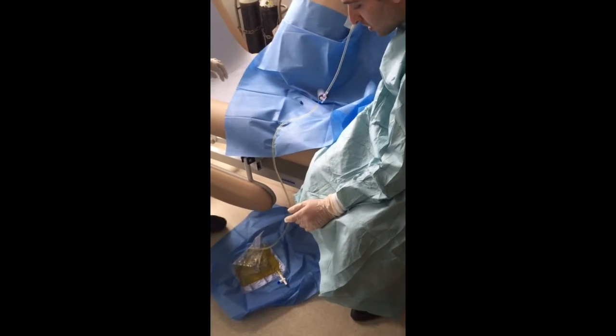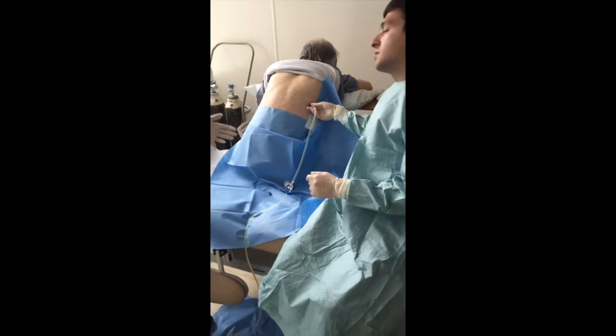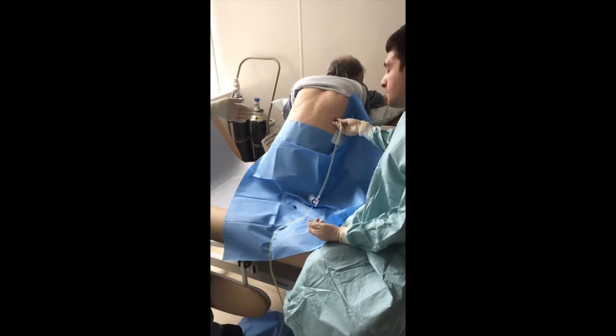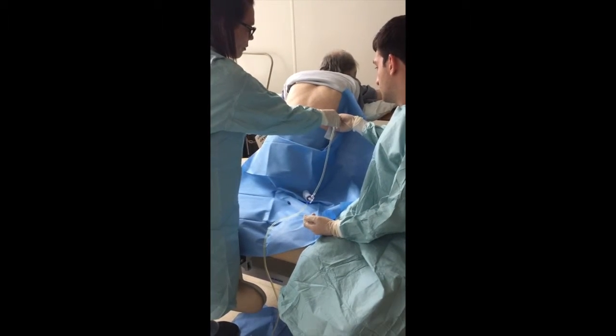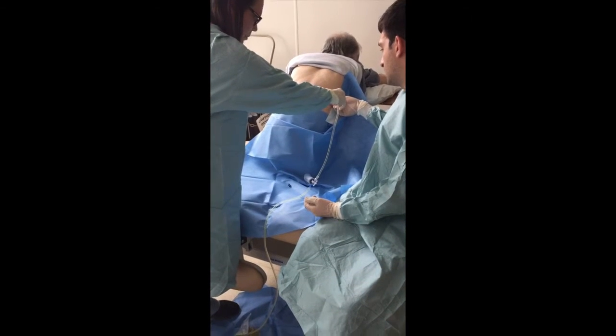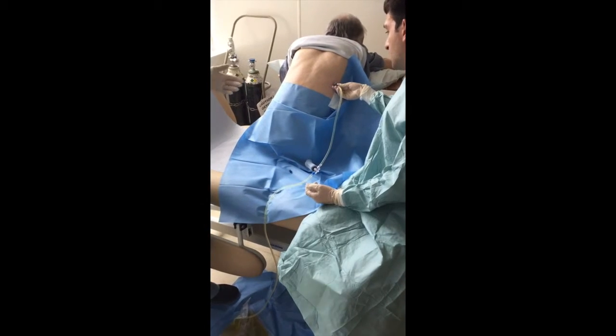If you lose your flow, then what you can do is you can get the patient to cough a couple of times, and what that does is increases the intrathoracic pressure. And again, you can also start moving your cannula, so just slightly out a bit, up a little bit, and it depends on the size of the effusion, how much fluid's there.